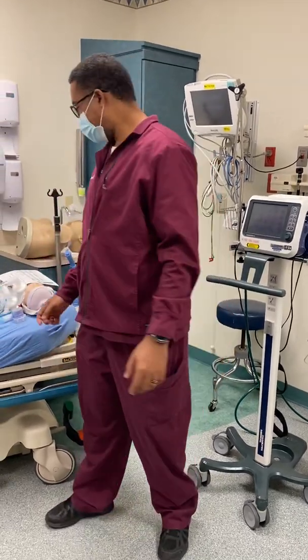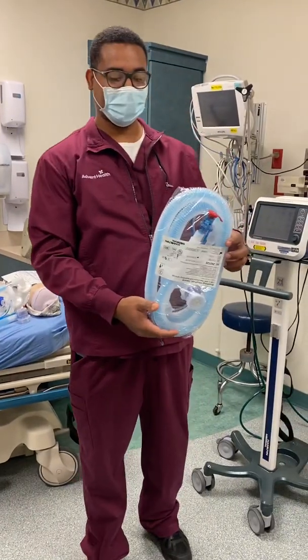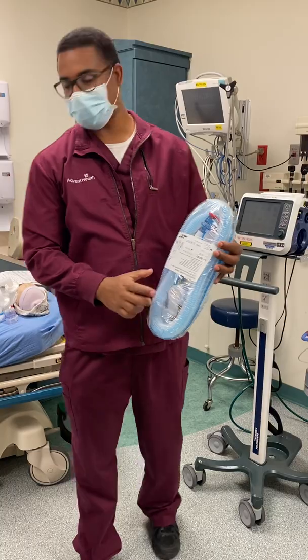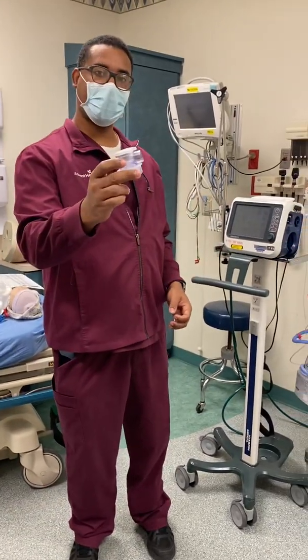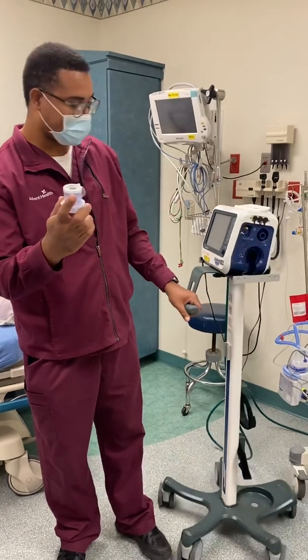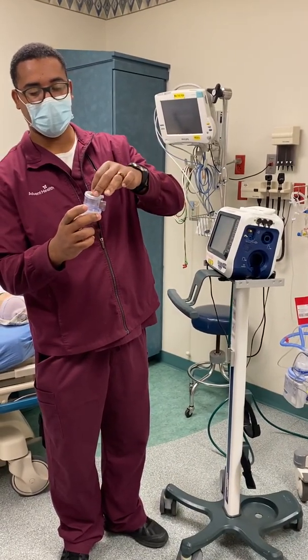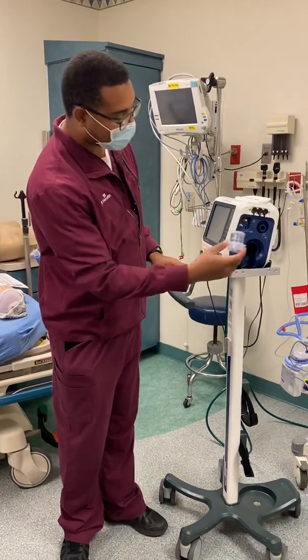Everything should come in a package looking just like this. As you can see, this is a valve cover that needs to come off. It should look just like this out of the bag. There's a little diaphragm here — you want to make sure that it stays on there nice and flush out of the bag.